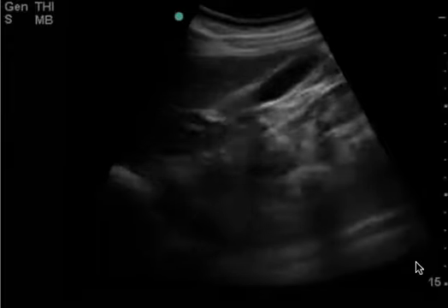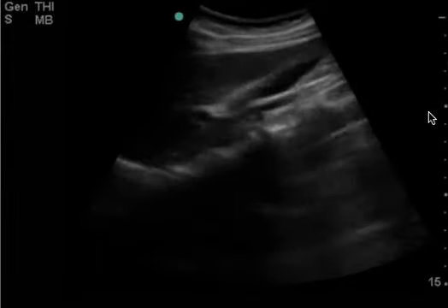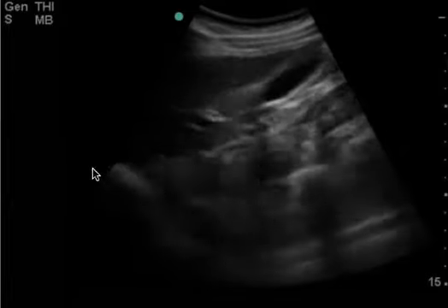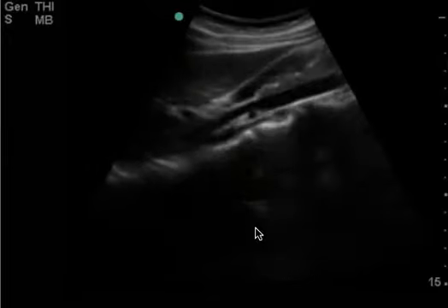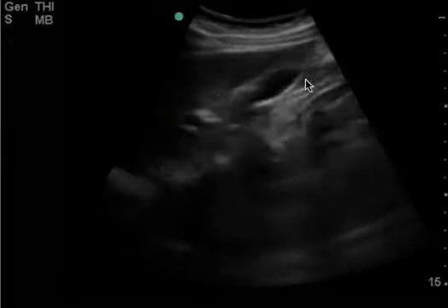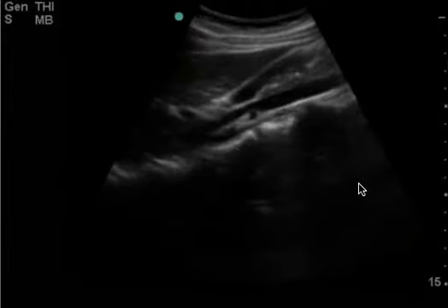I want you to focus on the fact that your depth is 15 centimeters and your gallbladder is pretty much at the 5 centimeter mark. All of this here is unnecessary space that's being viewed. So next time if you have someone like this who's this skinny, I would definitely decrease your depth.